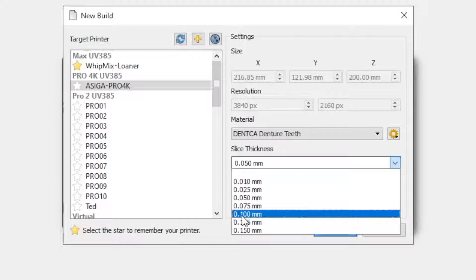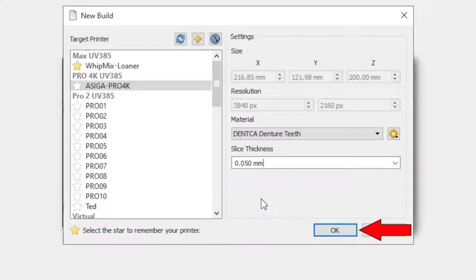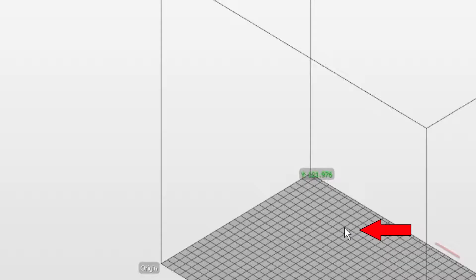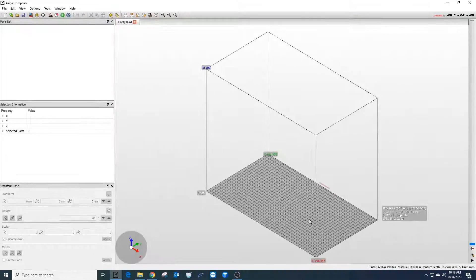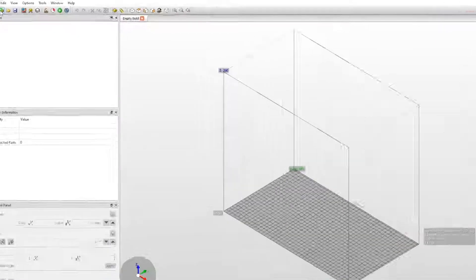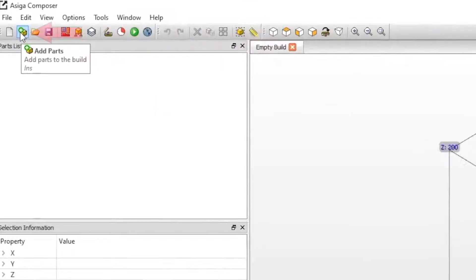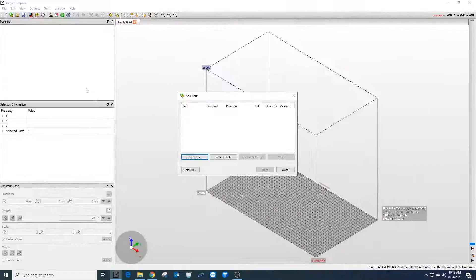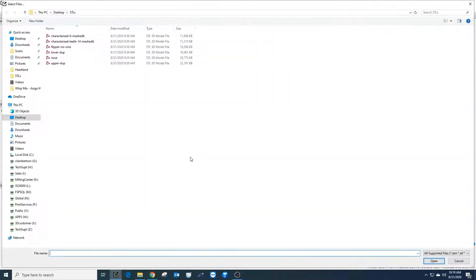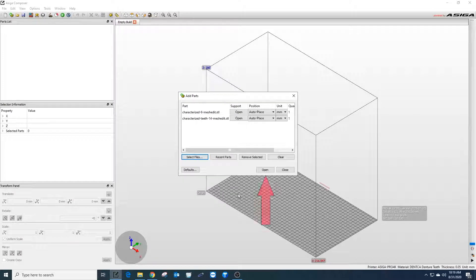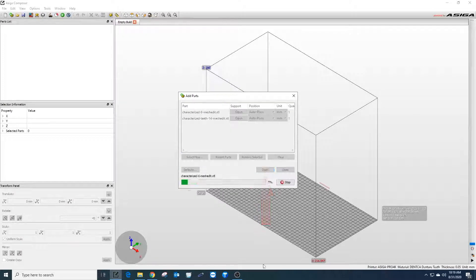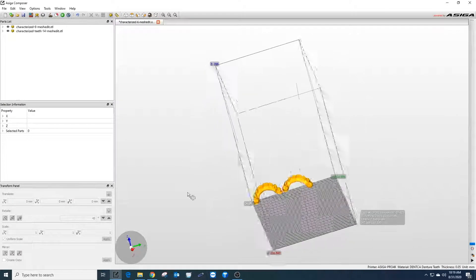The next step is to import the STL files to use. Click the add parts icon in the top left corner of the builder. Hit select files and choose the objects to print. Select open and then open again. Now both sets of teeth are viewable in the builder.